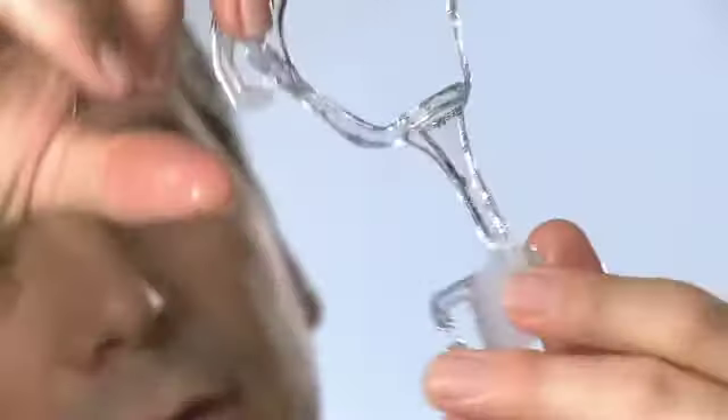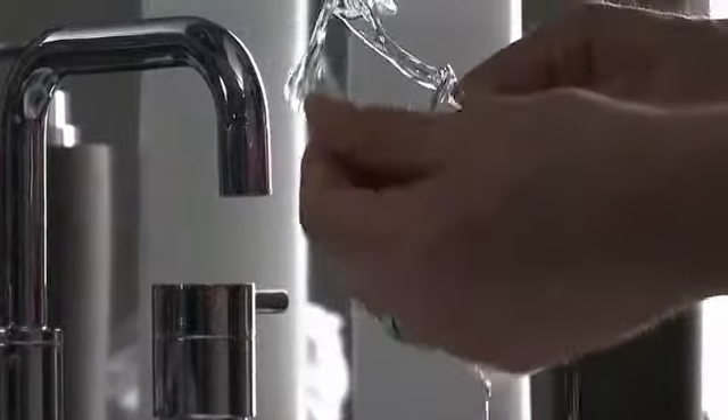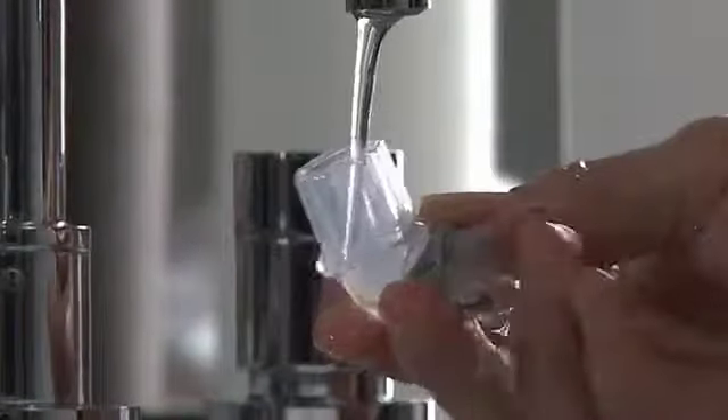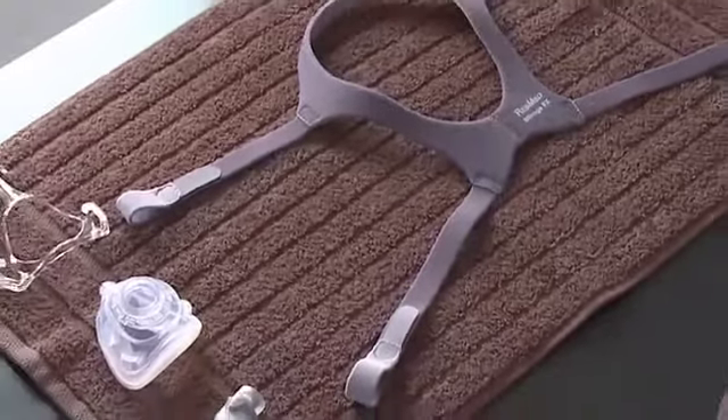Inspect each component and, if required, repeat washing until visually clean. Rinse all components well and allow to air dry out of direct sunlight.